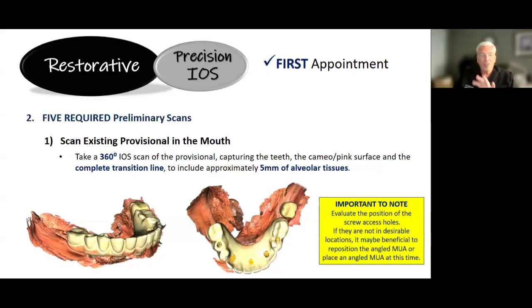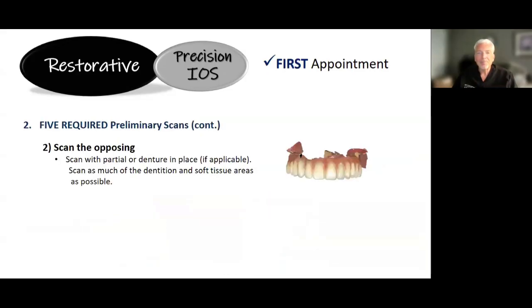So, I know I'm expanding on this. It's a very important part, and I see it missed, and I see the disappointment with patients sometimes, and the doctor's uncomfortable when they're explaining to the patient why this happened, why they did a composite plug, and to the degree they're able to match that, light reflects differently from zirconia to a composite plug, and even from a denture tooth. So just things to keep in mind here, folks.